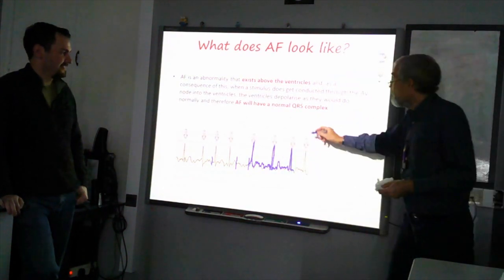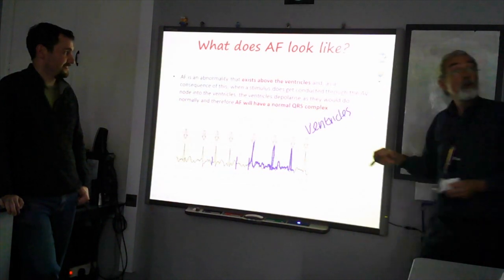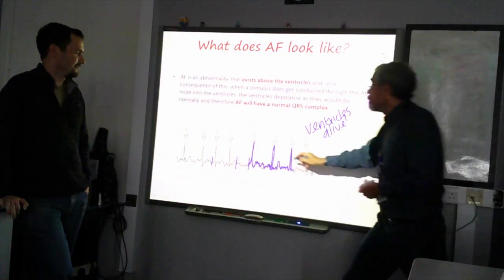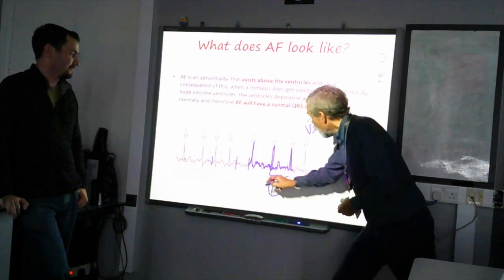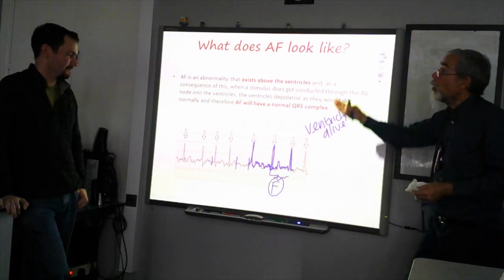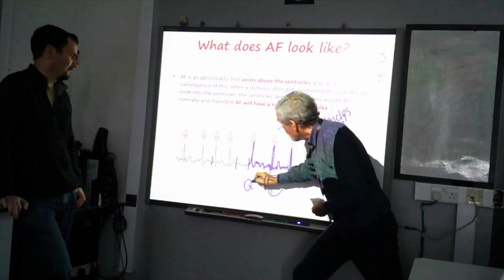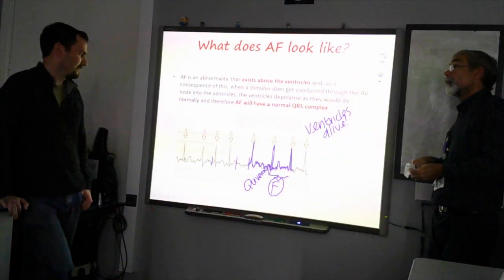So no P waves anymore, which means you still get the ventricles beating. And as long as the ventricles are beating, guys, you are alive. But what you've not got anymore is that lovely smooth P wave, which is getting the atria to contract. This represents the atria. Does that make sense, Phil?